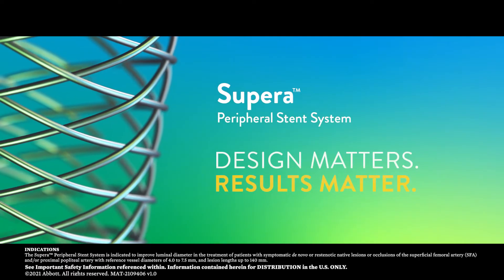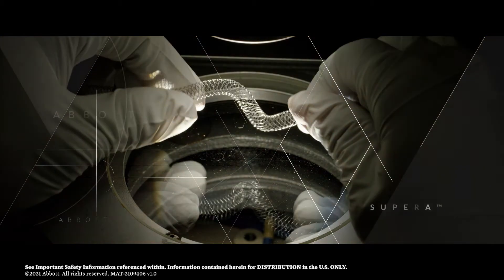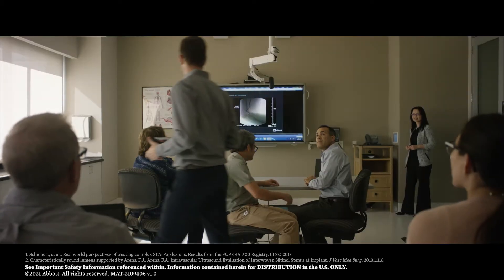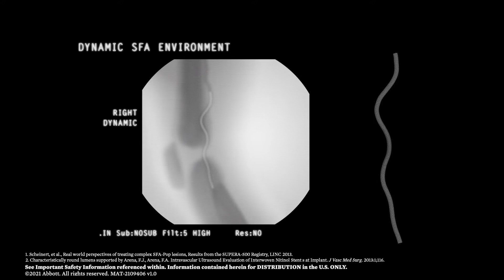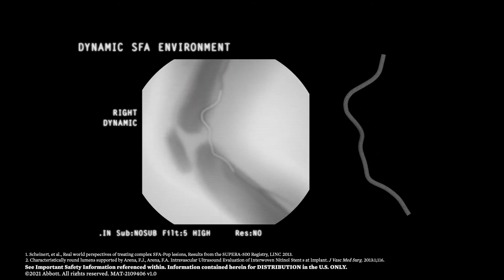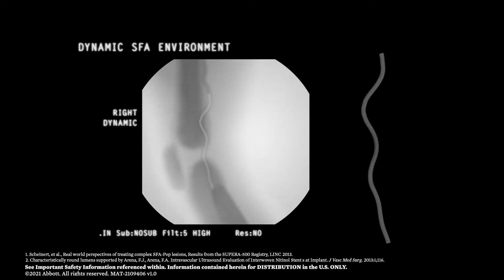In the complex world of peripheral intervention, the Supera Interwoven Stent empowers you to conquer the most complex lesions. Developed through breakthrough engineering, the interwoven nitinol design of Supera supports and mimics the natural structure and movement of the anatomy, which twists, bends, shortens, and compresses.